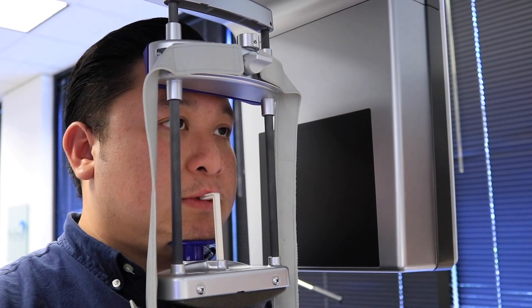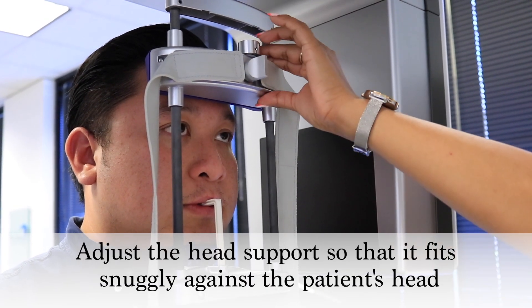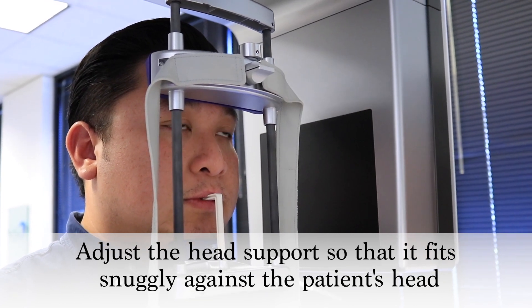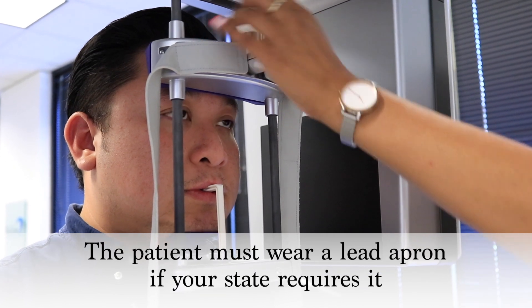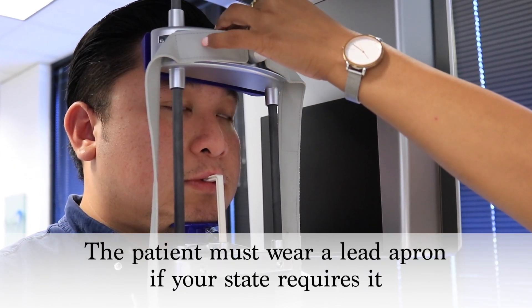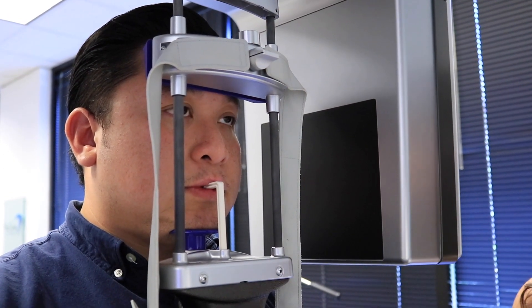Turn knob one into the vertical position and adjust the forehead rest at the patient's eyebrow level. Turn it horizontal to lock it into place. Turn knob two two to three times to loosen it up and gently push the knob forward to meet the patient's forehead. Turn it all the way to the right to lock it into place.